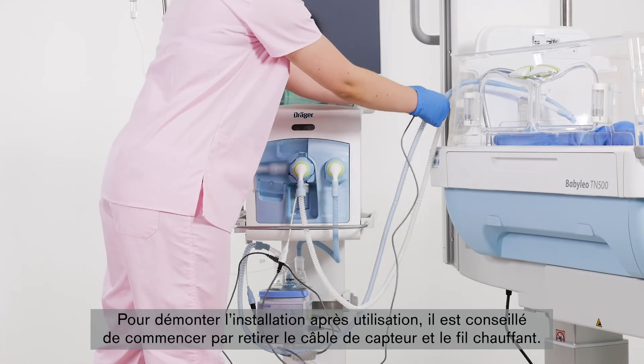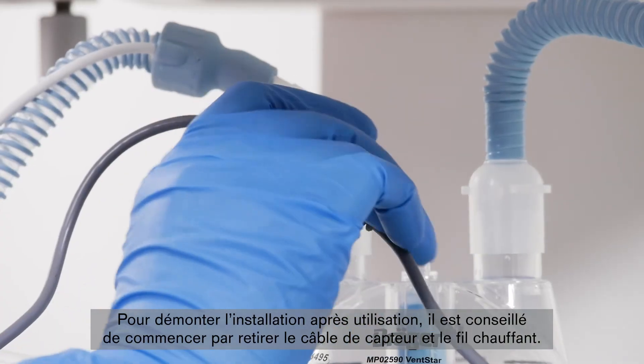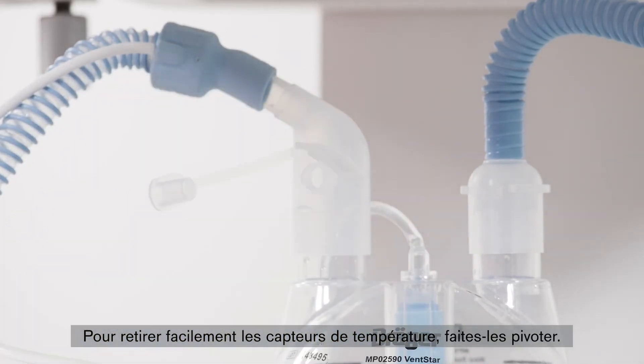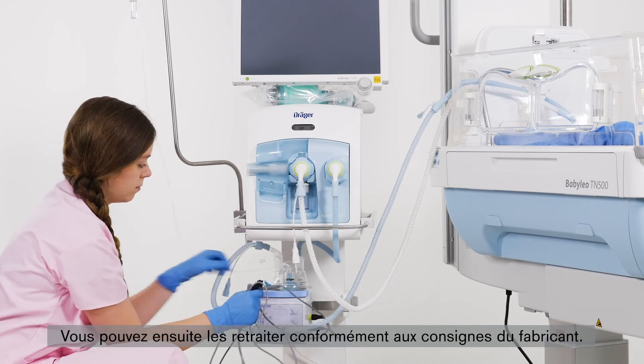When dismantling the system after use, it is advisable to start by removing the sensor and heating cables. The temperature sensors are easier to remove by rotating them. They can then be reprocessed according to the manufacturer's instructions.